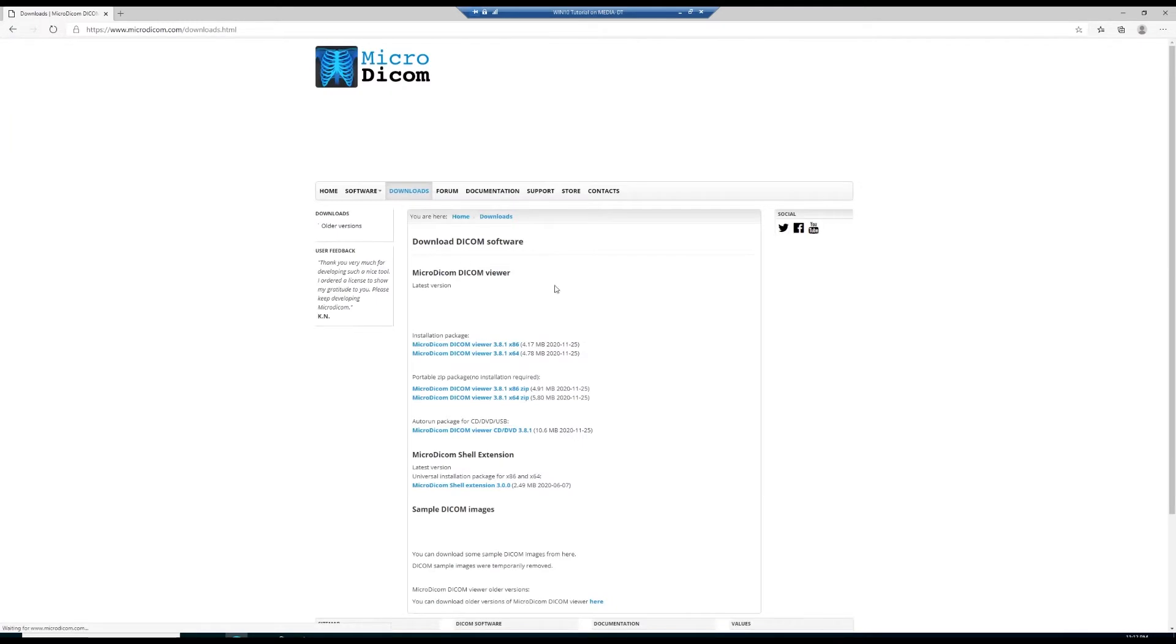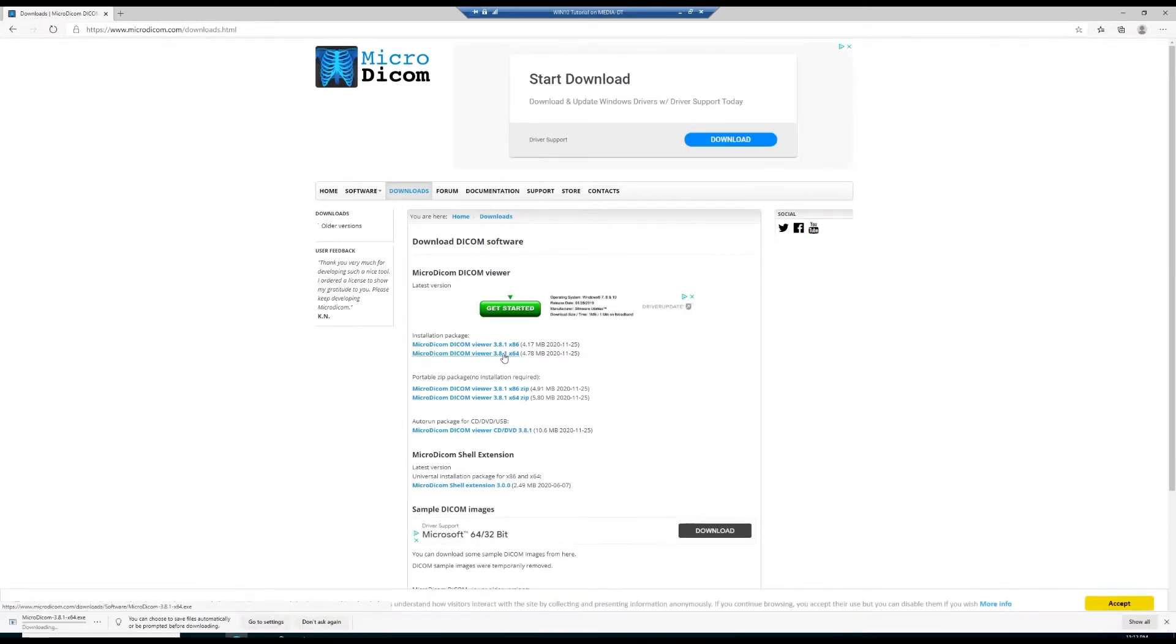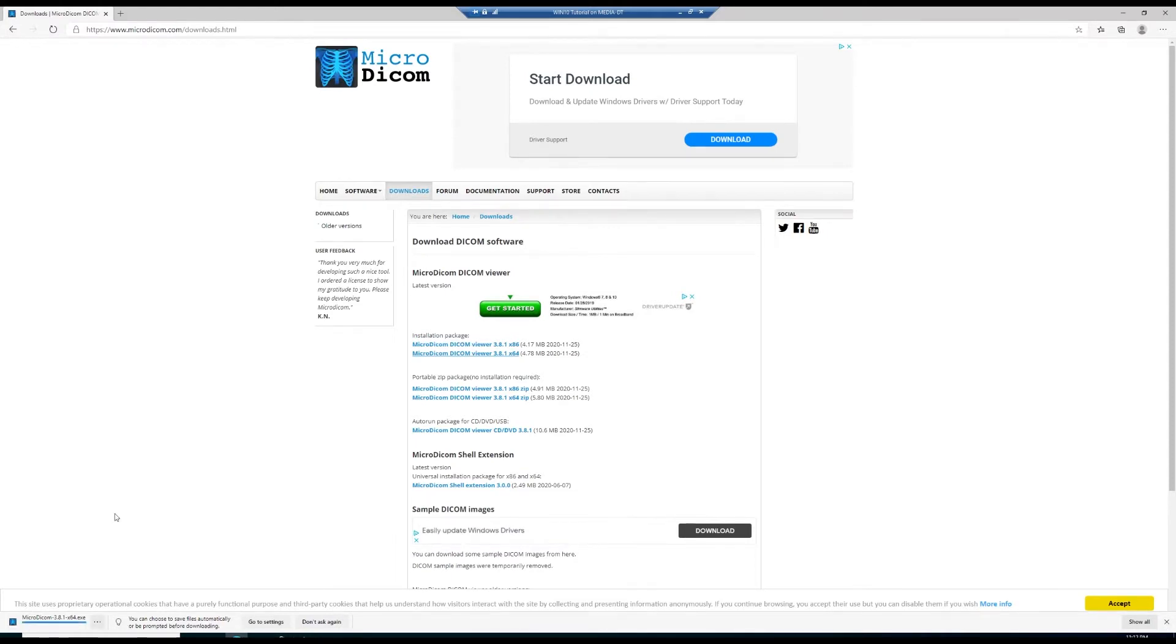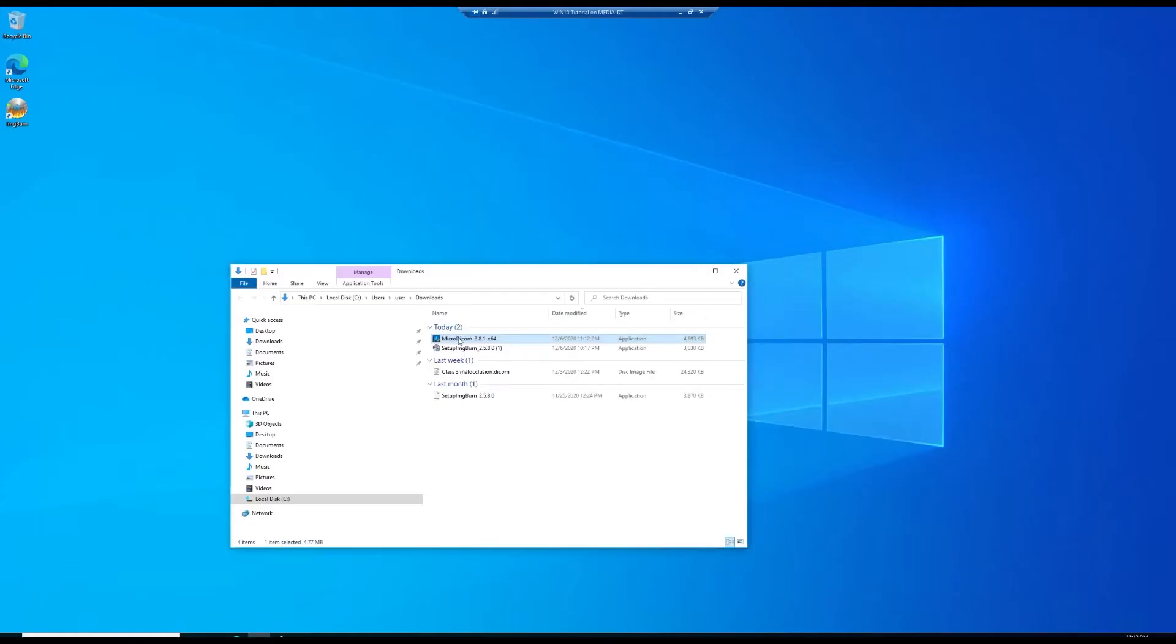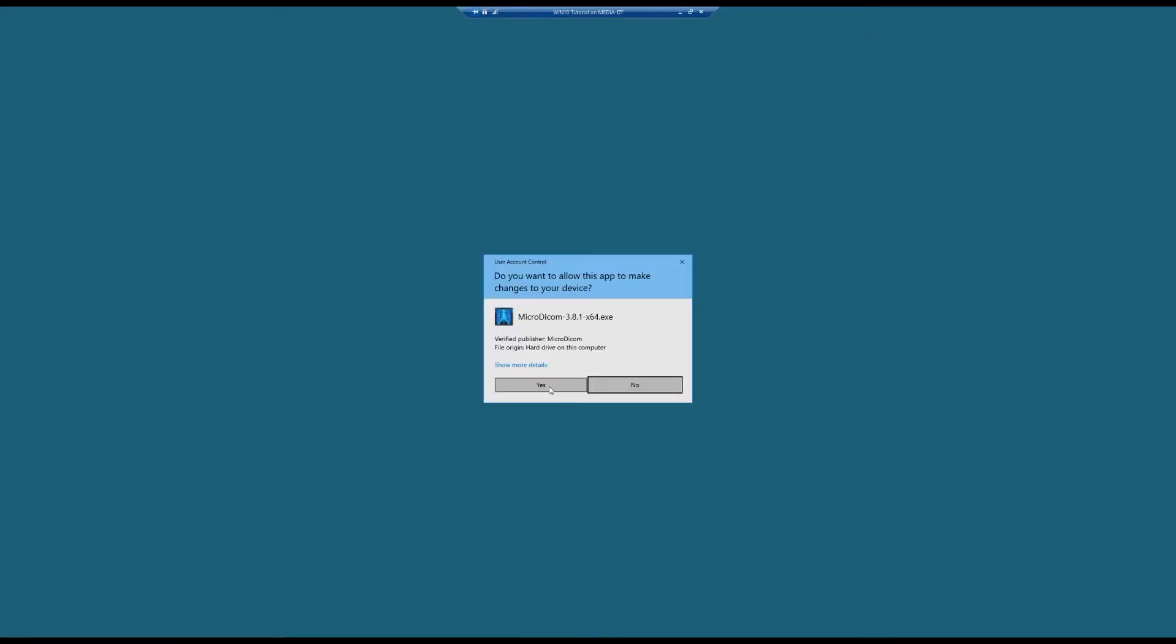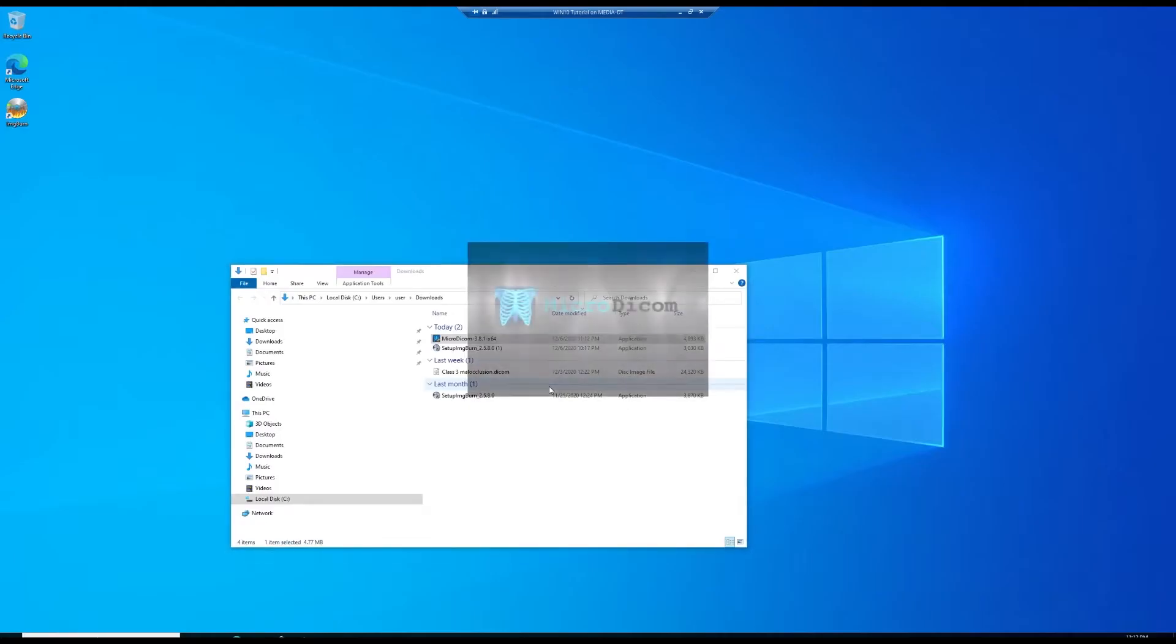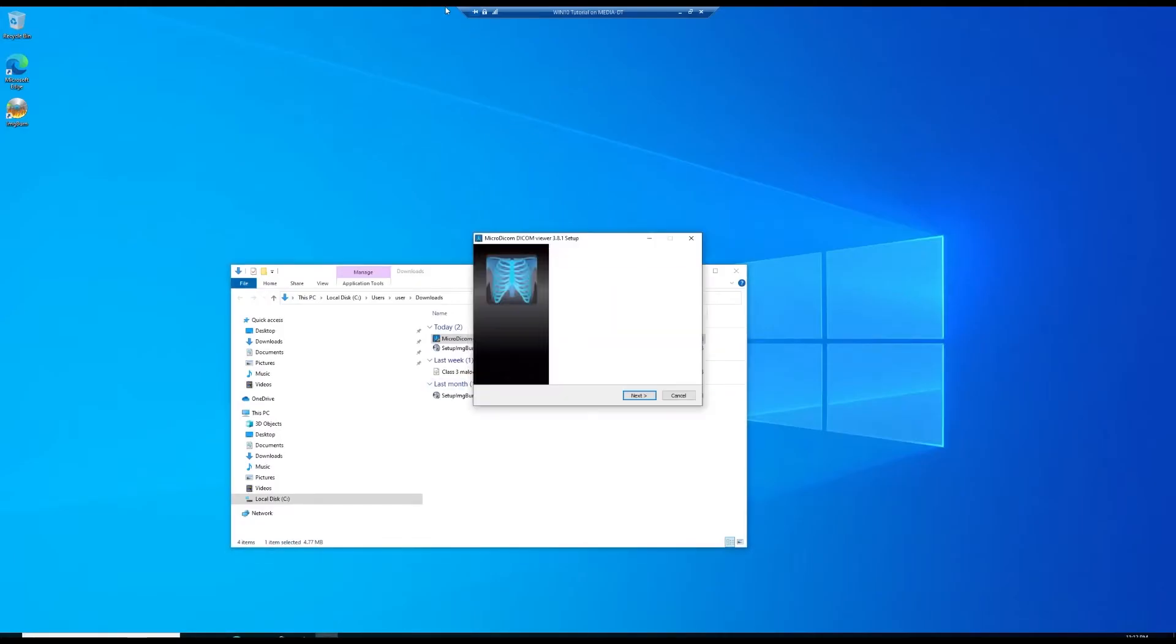The address for that is microdicom.com. I have a 64-bit PC so I'm going to go ahead and download the 64-bit version and run the installer. Here's MicroDICOM. Yes, we want to allow it to make changes.